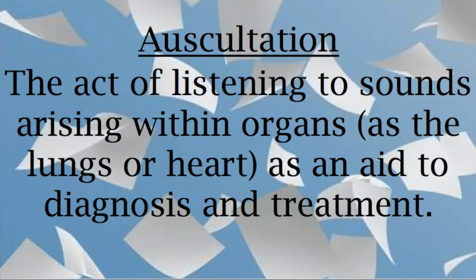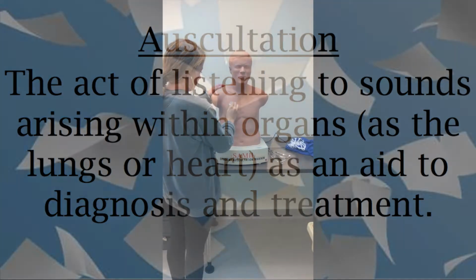The purpose of lung auscultation is an evaluation technique used to confirm the findings of chart assessment and inspection, to rule out cardiopulmonary dysfunctions, and for the reassessment of a patient's ventilation following treatment techniques to improve bronchial hygiene.